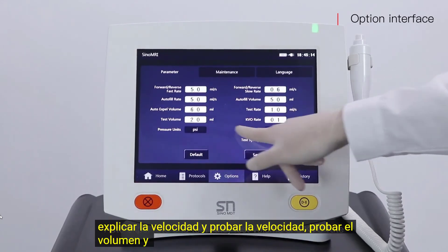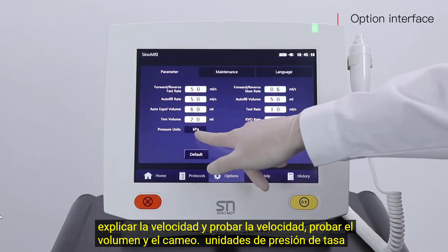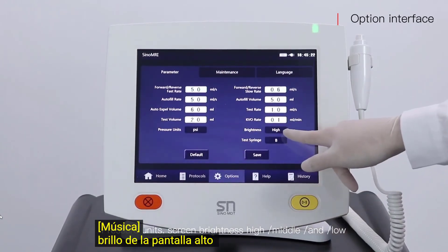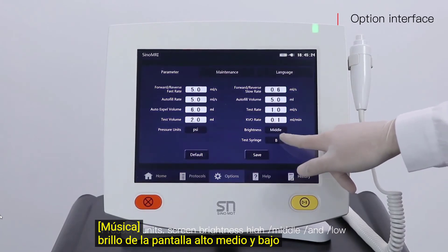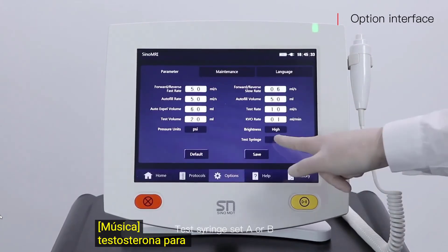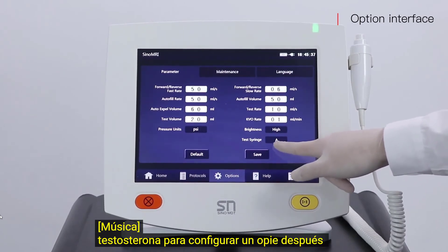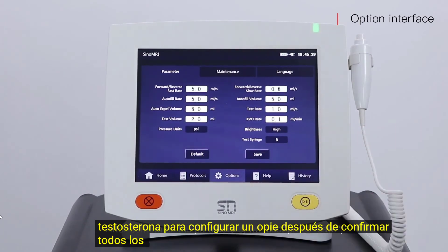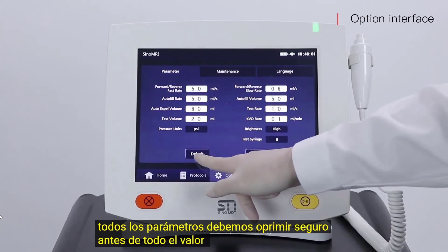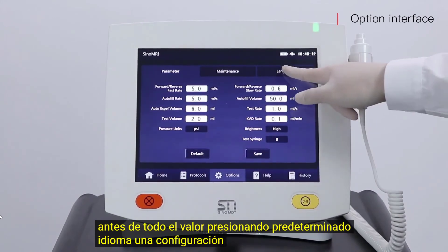Additional options include test volume, KVO rate, pressure unit, and screen brightness — high, middle, and low. You can also set test syringe to channel A or B. After confirming all parameters, press save. Press default to restore all values to defaults. Language settings are also available here.